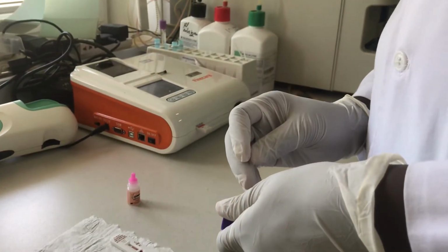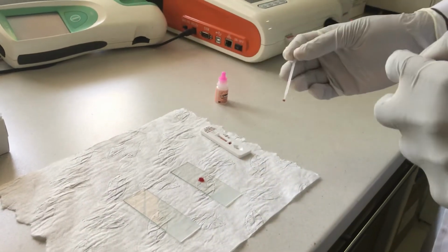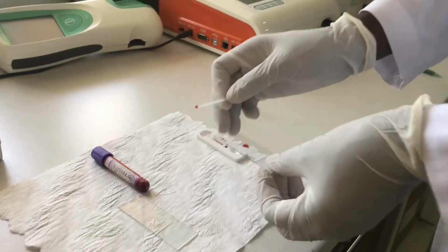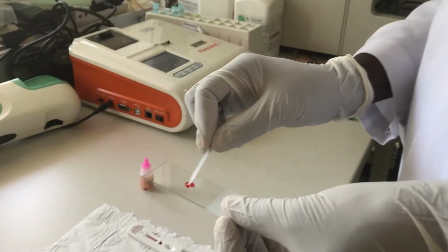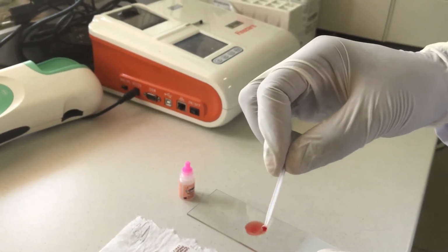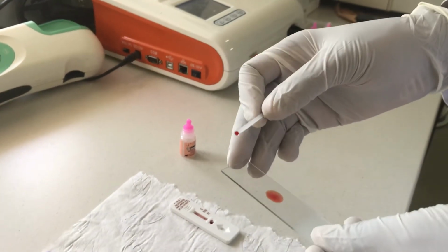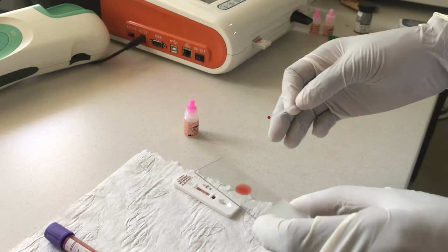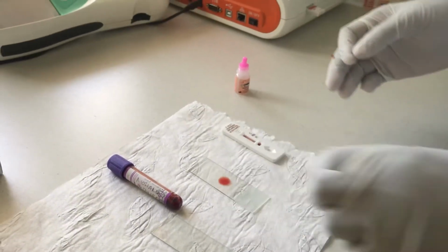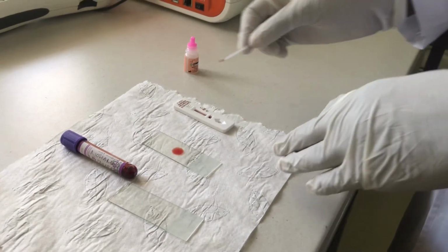So you add your smear in the middle of the slide, like that, and you spread it in a circular form to this diameter. Okay? So when you have your smear, not too thick, not too thin, it can be translucent. This is a standard thick smear, not so wide, but in the middle of your slide. Okay?